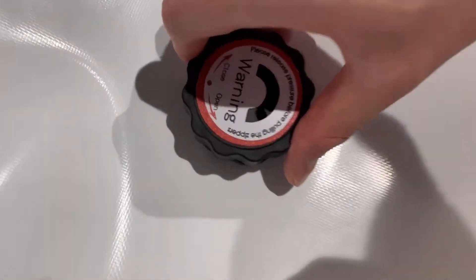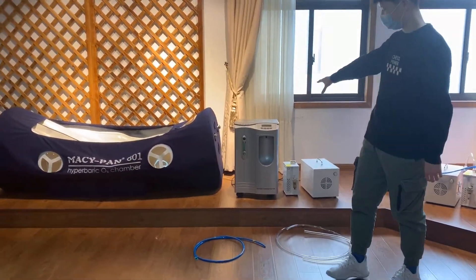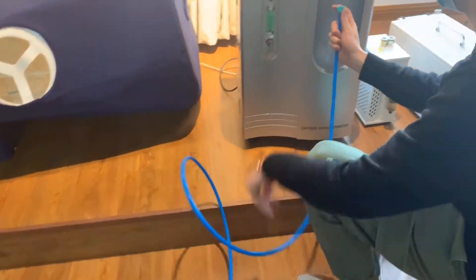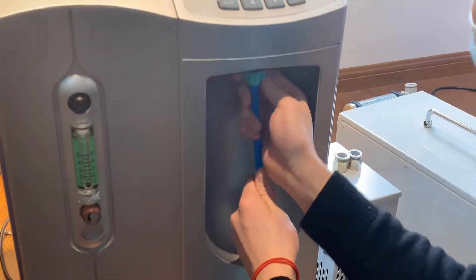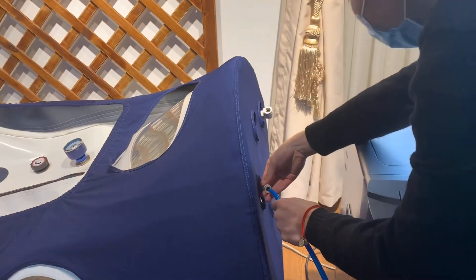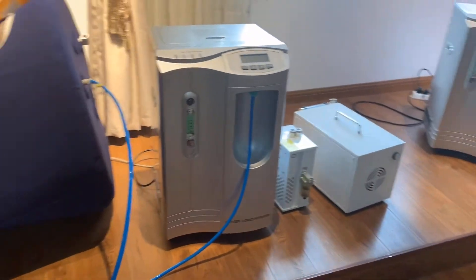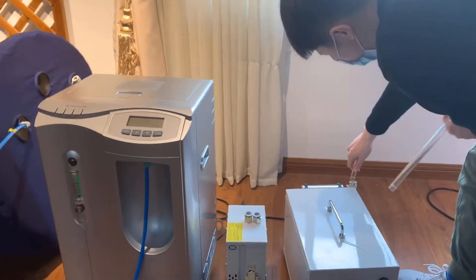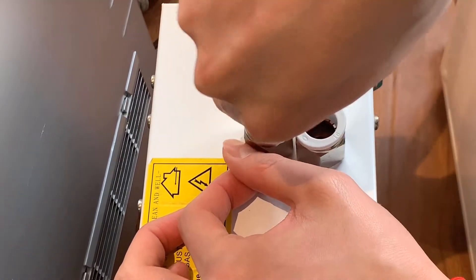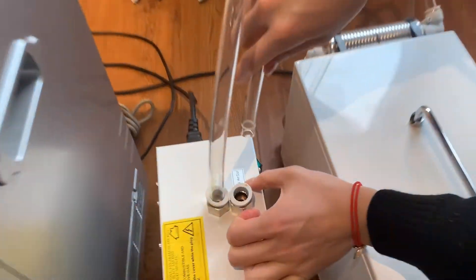And this is the pressure relief valve. Let us connect the chamber. The blue tube connects the oxygen concentrator to the chamber, and the clear tube connects the air compressor in.